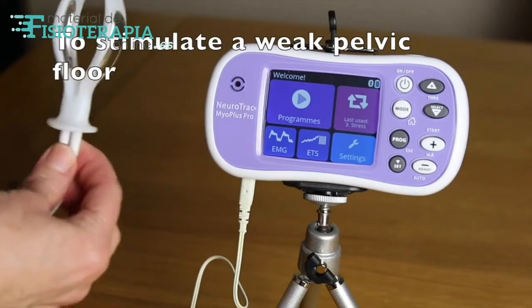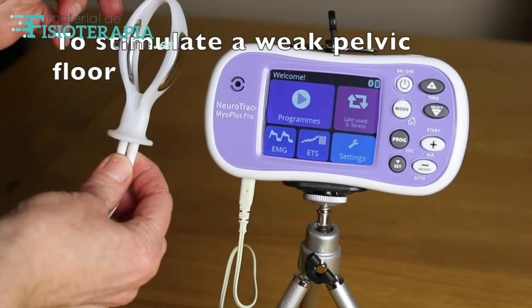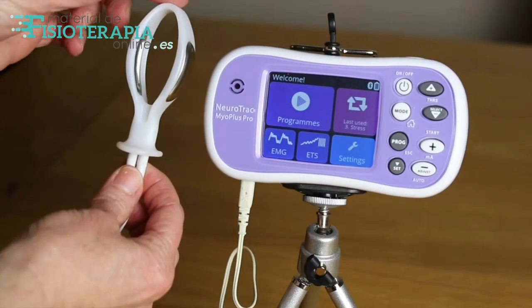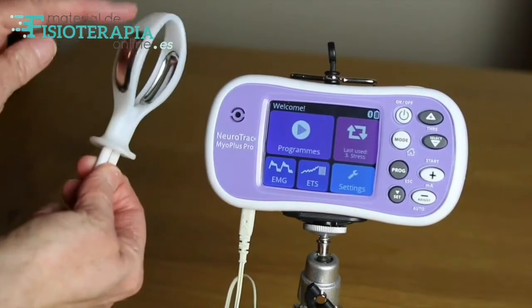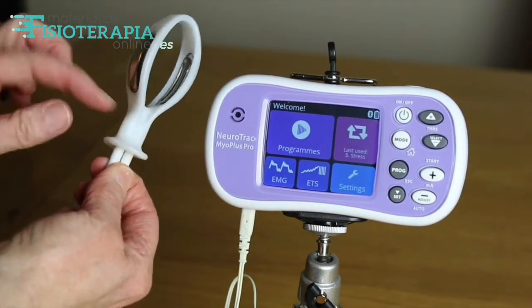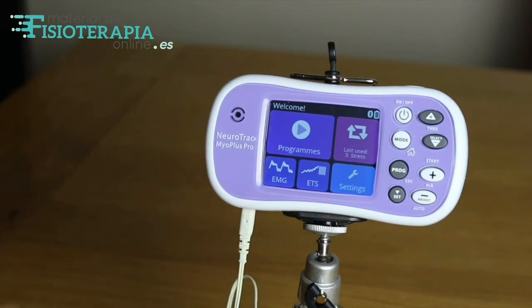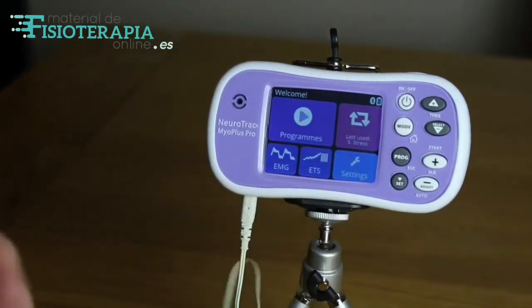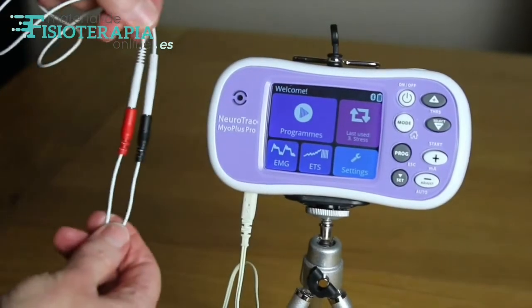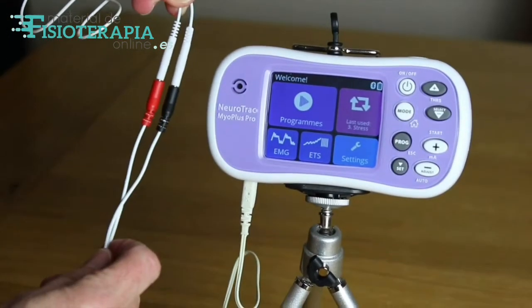To stimulate a weak pelvic floor we use the Periform electrode vaginal device. Once inserted into the vagina, the sensor plates sit alongside the muscle and deliver the stimulation. I'll use surface electrodes to demonstrate the effect. Always ensure that there is a good connection between the cables and no metal is exposed.